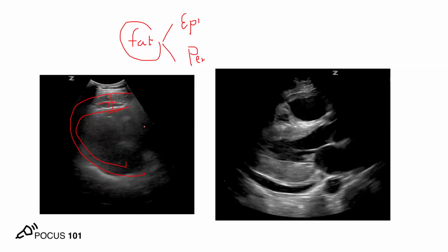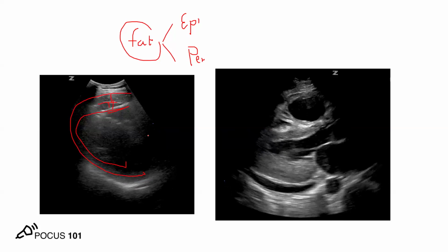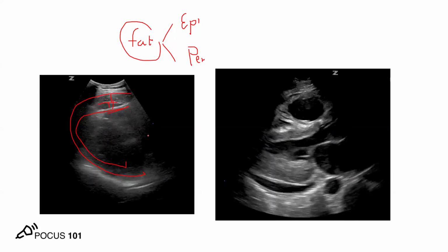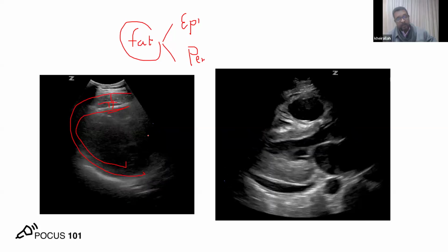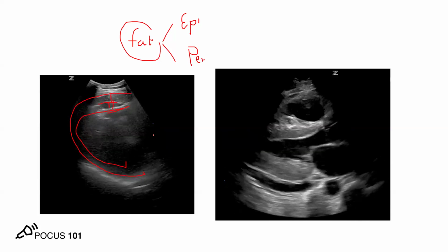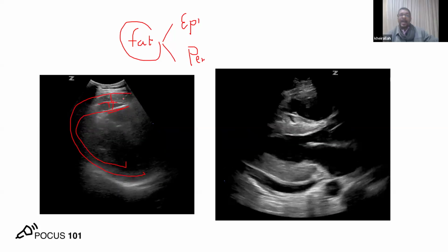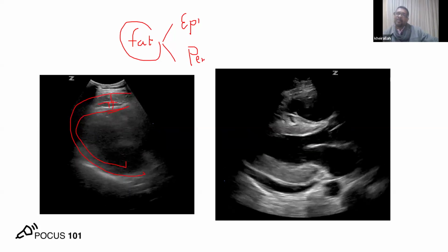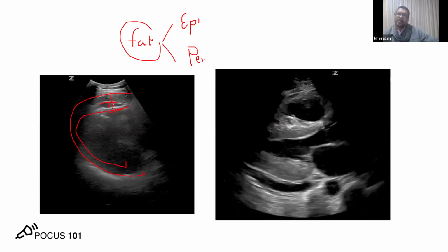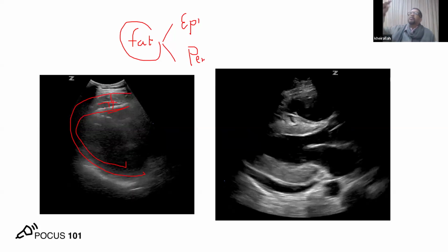So, Dr. Hatim, اتفضل. If there is pericardial fat, يعني if I found this, should epicardial fat and pericardial fat be found together to say this is the fat, not effusion? Yes. Together should be there. الاثنين معلش لازم يكونوا قاعدين. Yes. لكن ما شرط يكونوا واضحين زي الوضوح دي. يعني في بعض الأحيان small bits of fat in here and here hardly seen, لكن مرات بيكونوا very large.